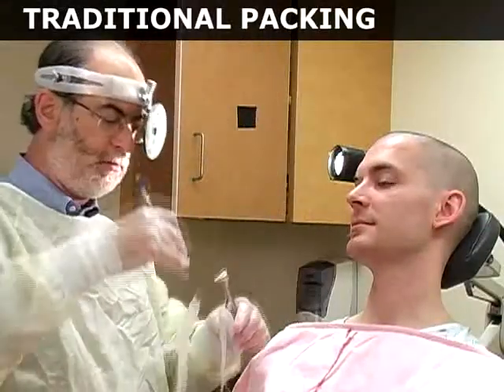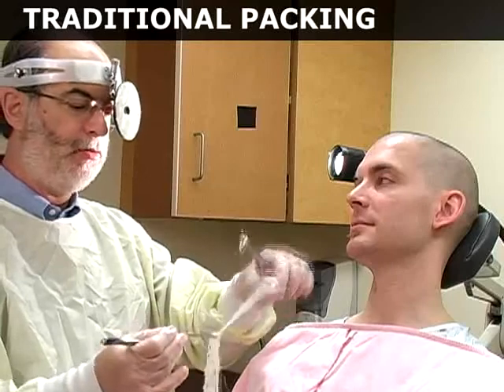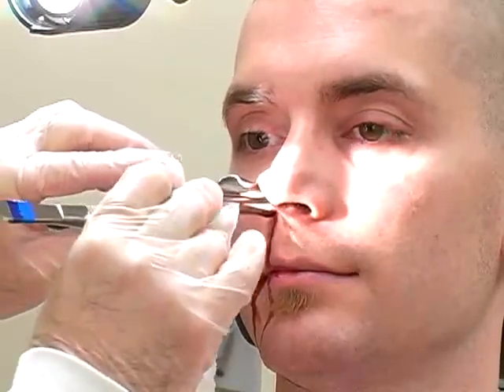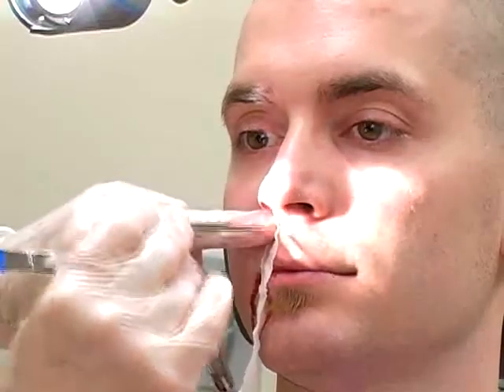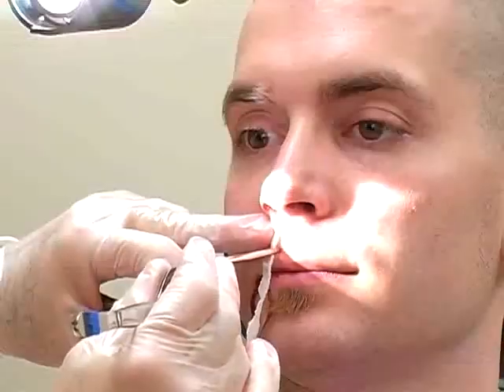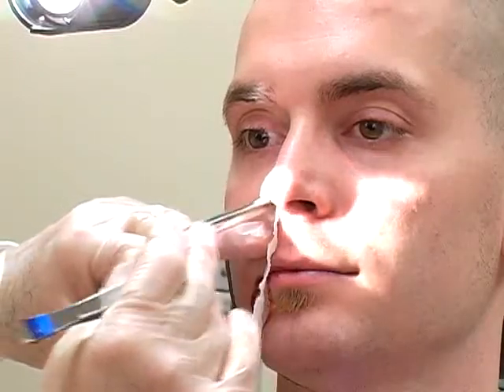Traditional nasal packing is performed with cotton ribbon gauze soaked in petroleum jelly or bismuth iodoform paste. Use a bayonet forceps to advance one end of the gauze along the floor of the nasal cavity until you meet resistance. Remove the forceps and advance another layer of gauze on top of the first, and then continue the insertion in an accordion-type fashion.